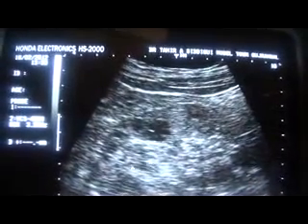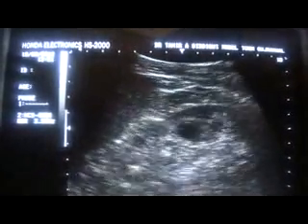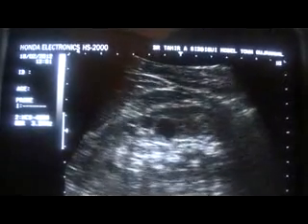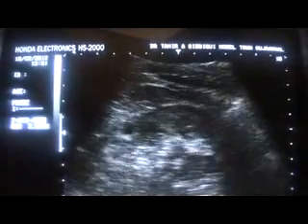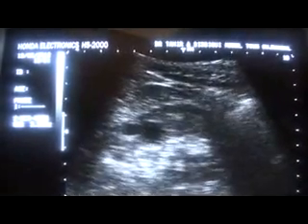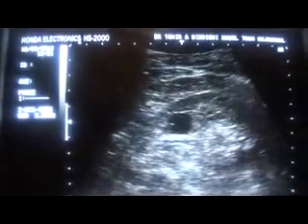In this kidney, the central sinus echo complex is a bit muffled as compared to that of the right kidney, but it is present. However, there is no cyst in the central sinus echo complex, whereas there will be cysts involving the central sinus echo complex in polycystic kidney. So this is a case of multicystic kidney.